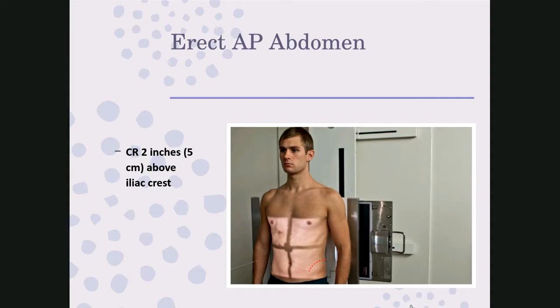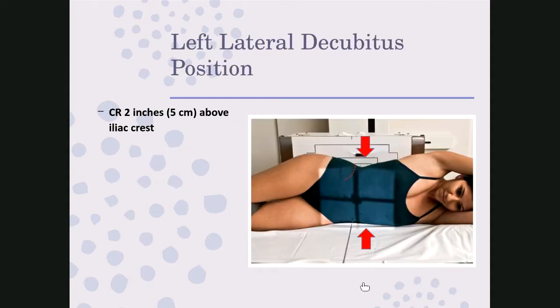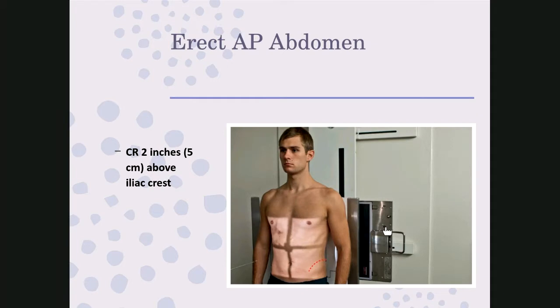Now notice, this patient and our last patient both tend to be on the stenic side, which means that they would fit on one 14/17 image receptor lengthwise. That's not always going to be the case, and we'll talk about that in just a few minutes.